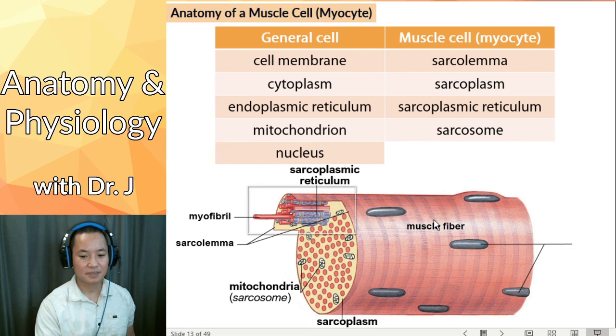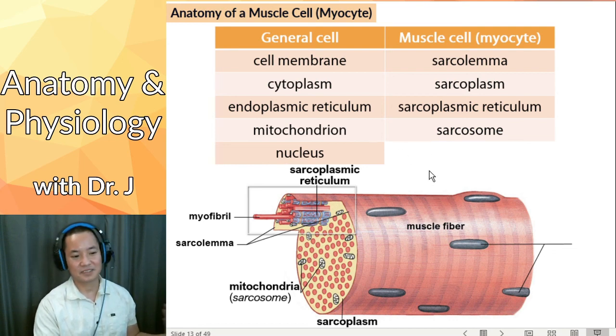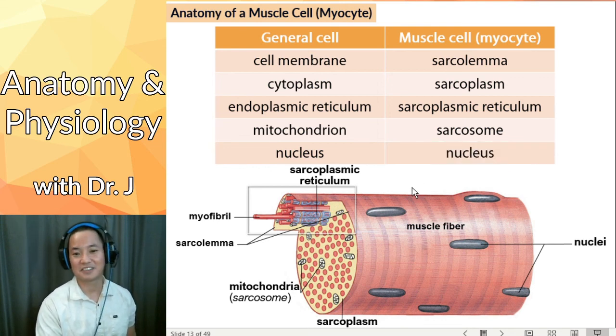And then we have the nucleus. So what's the nucleus of a muscle cell called? Thankfully, they don't give it a special sarco name, so they call it just the nucleus. I know.